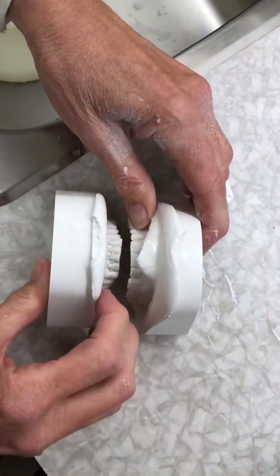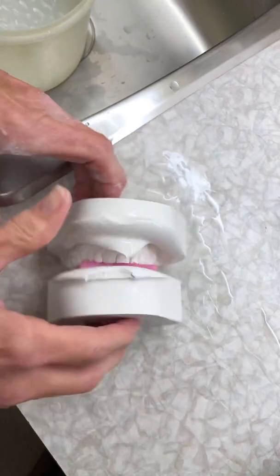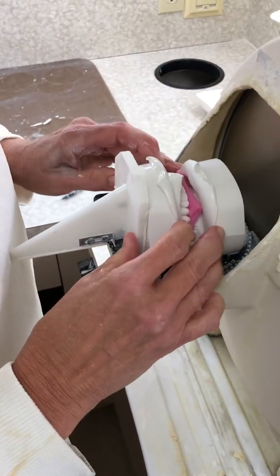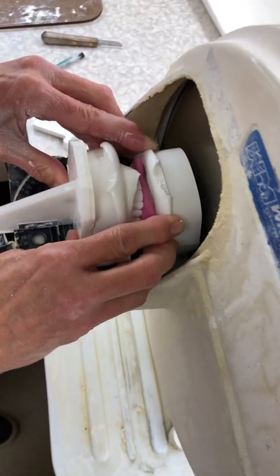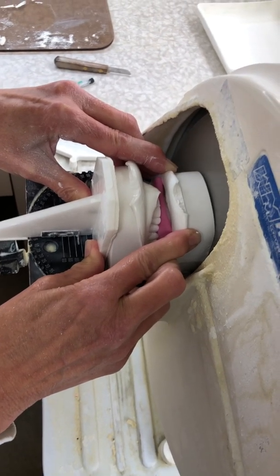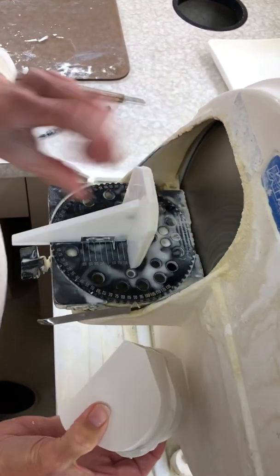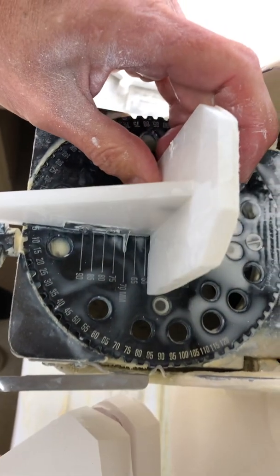So that's good. Now, the only thing we have left to do, let's put the wax bite in again so we don't do anything to that. And now we want to make sure that this is parallel with the top. So again, we'll use this bottom and we'll push up against there, and again I'm going to hold there tight, and we're going to slide in. Now, when you're doing an orthodontic model, they want it trimmed to 70. All right, so I don't know if you can see that, but that's where you want to trim. So that little line should be at the 70.